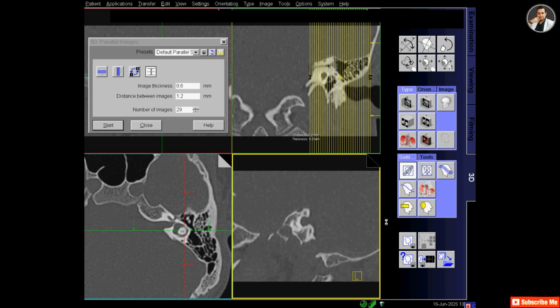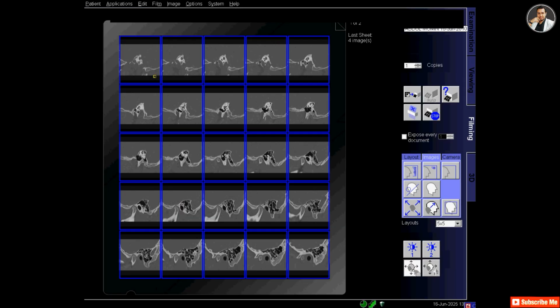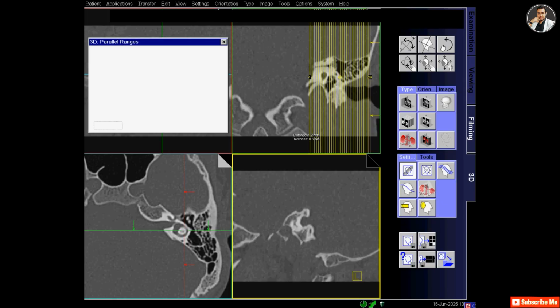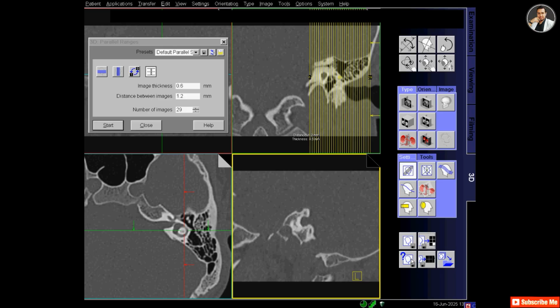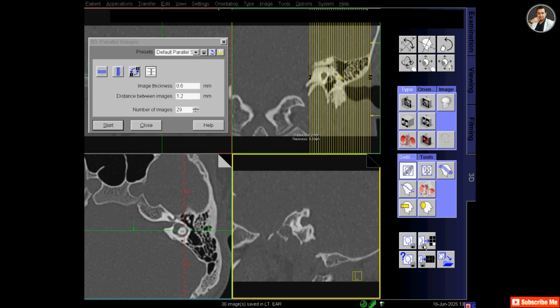and now send it to the filming. Sorry, I forgot to save as comment. Give comment. I will comment left ear, and also the range series name will be left ear, and then OK, and then I will send to the filming and also the reference image.